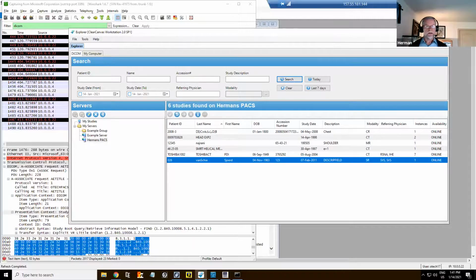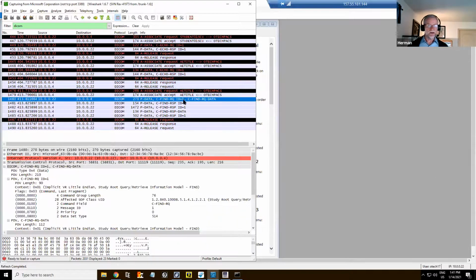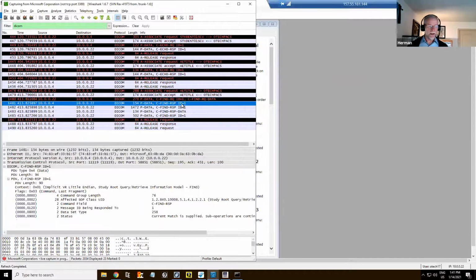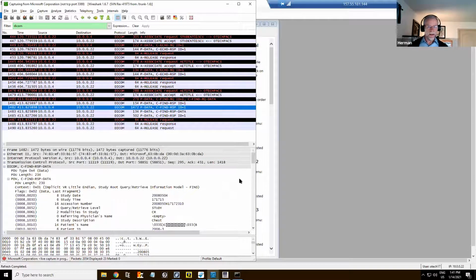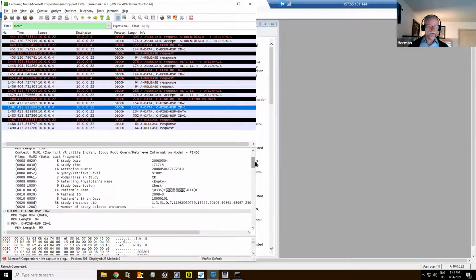Let me make it a little bit bigger so we can see it better. Okay, let's go look at it. So I had my C-find, so after it was accepted, I did my C-find request right here, and got a response back, and then I got my data. So I got my first data.